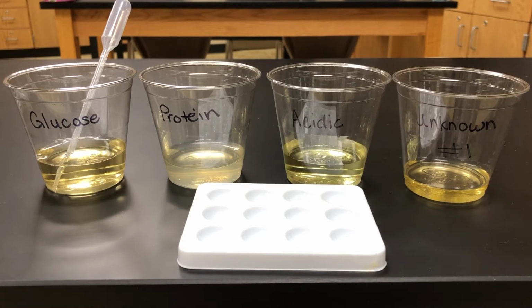the table below. Now on the glucose test strips, the instructions on the packaging are to dip the test strip into the test solution for 1 to 2 seconds, run test strip along the edge of the container to remove excess liquid, read against the color chart after 2 minutes for the urine test.